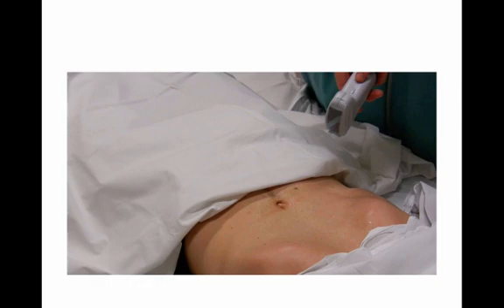Let's see an example of this. In this clip, you can see that the ultrasonographer is pointing out the ultrasound marker on the probe. When she places the ultrasound probe on the patient, this marker will face the patient's right side, over here.